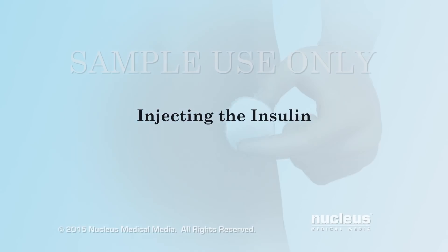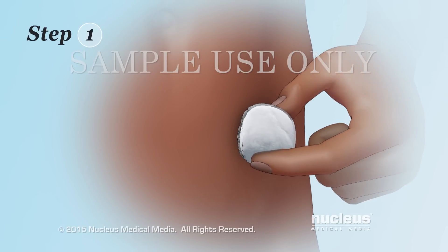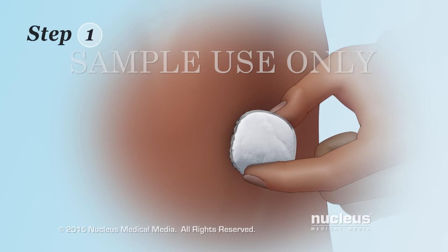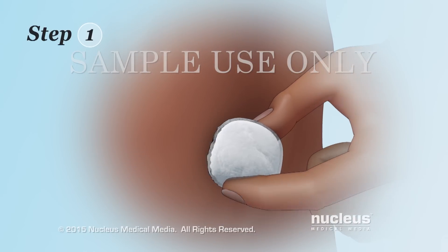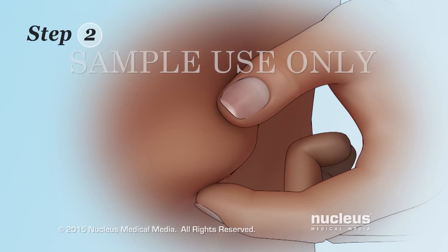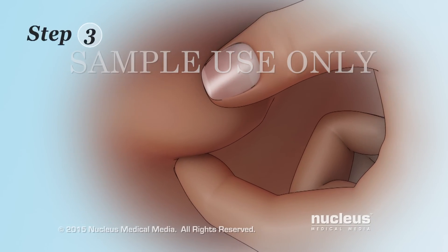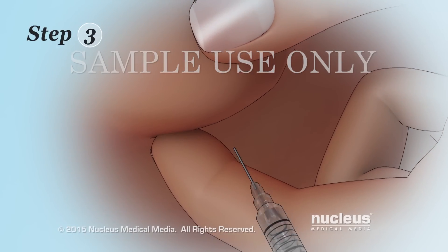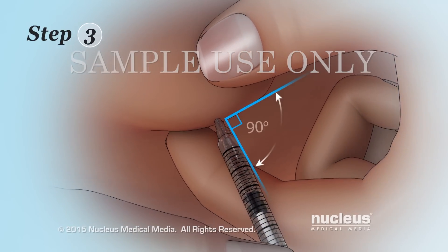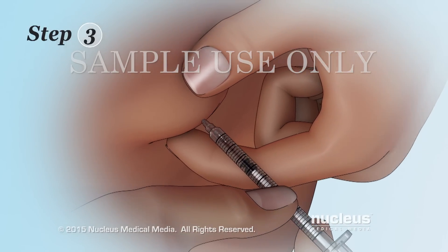Injecting the insulin. Step 1: Clean your injection site with an alcohol wipe. Use a circular motion to clean a spot about 2 inches wide. Step 2: Pinch a 2-inch fold of skin in the cleaned injection spot. Step 3: Hold the syringe like a pencil and quickly insert the needle straight into your skin at a 90-degree angle. Make sure the whole needle enters your skin.